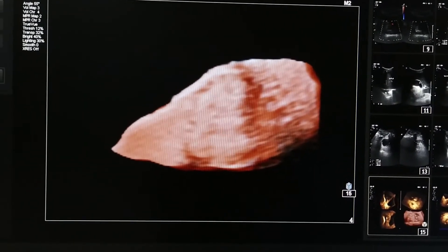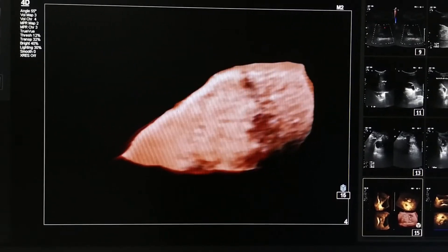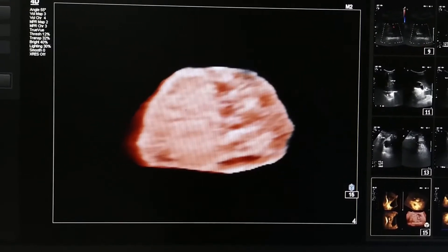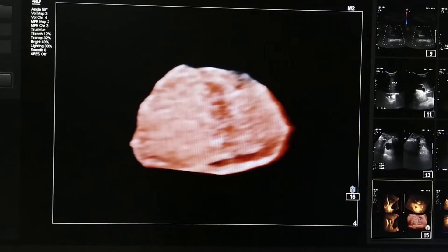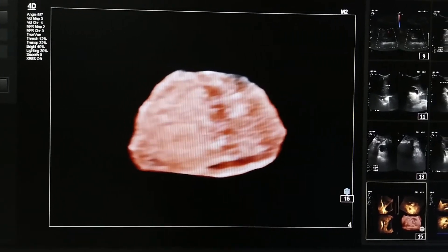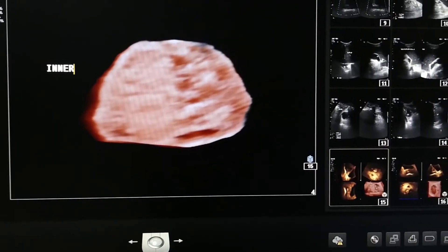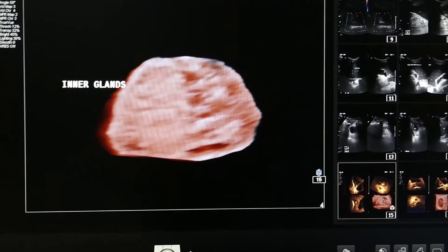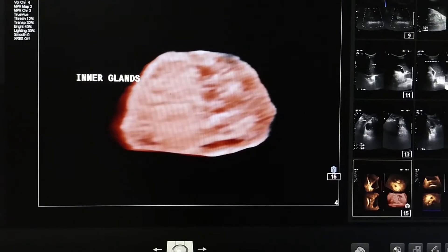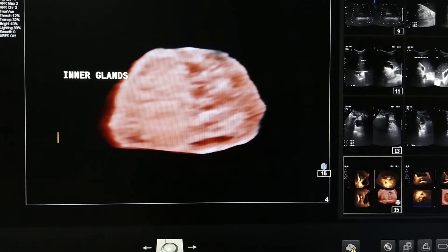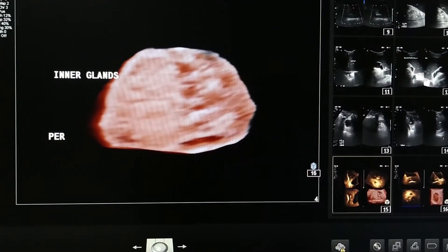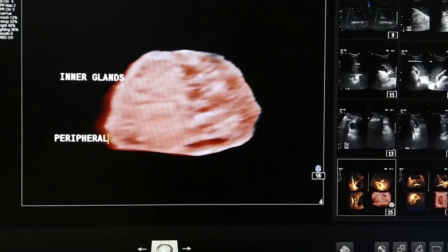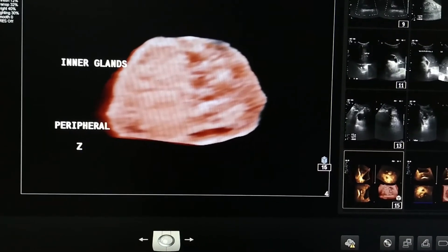Now again, I am rotating to see the prostate in axial cut from the sagittal plane. The anterior or upper part of the prostate is the inner glands containing central and transitional zones — a common site for benign adenoma. The posterior part contains the peripheral zone, where malignancy is common.